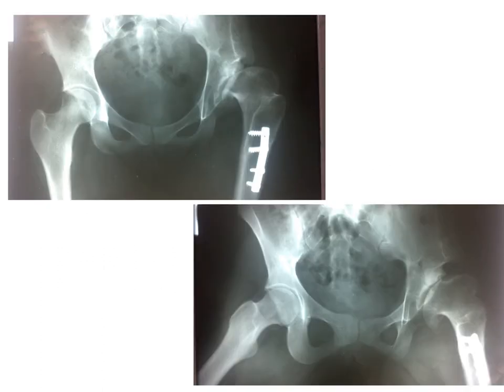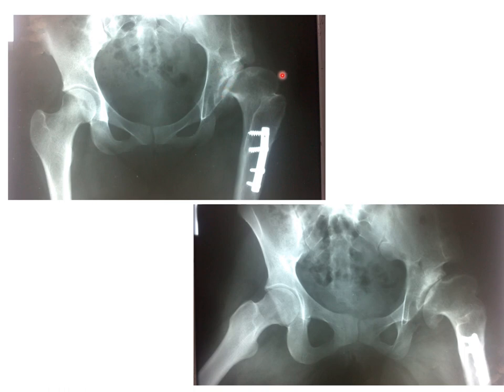This is the x-ray that the patient presented to us with. You can see a plate for correctable osteotomy which had this dislocation of the hip, the subluxation and mushrooming of the head, the shallow acetabulum, and the donor side of the graft taken for the Salter operation. This frog-view lateral shows how the head is quite large.